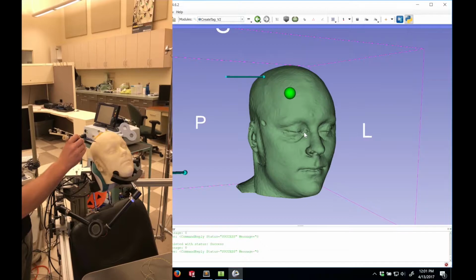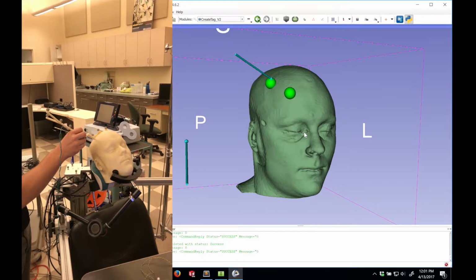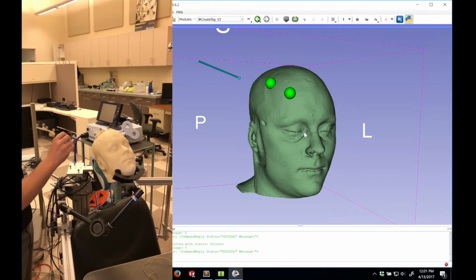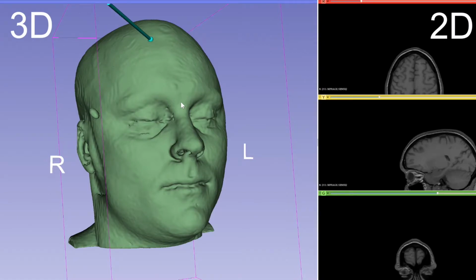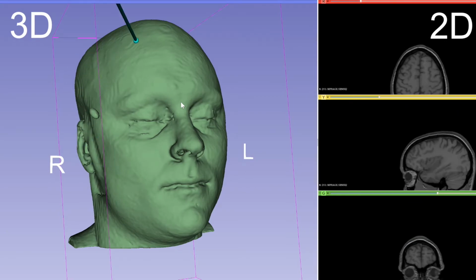Haptic feedback has also been implemented. Another tag is created and feedback demonstrated again. This allows the surgeon to navigate traditional neurosurgical tools while receiving heads-up alerts about the position of the tool with respect to tagged areas. In addition to tag information, the system provides a traditional stereotactic interface displaying DICOM information in 2D and 3D reconstructions of patient anatomy.